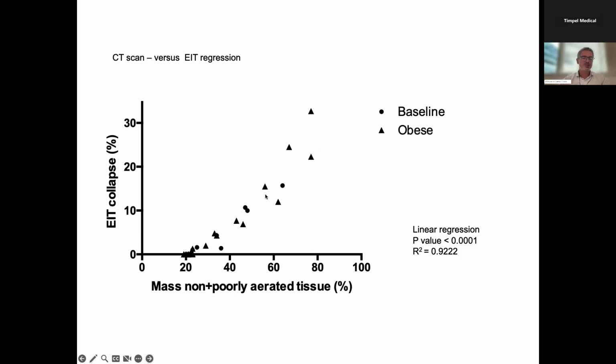So what this plot indicates is that there was roughly 20% of the lungs that, even at the optimal PEEP, was still 20% closed. 20% of the lungs was still closed even at the higher PEEP levels. So meaning that part of the collapse that you measure with CT could not be recruited by the pressures that you expose the lungs to. So this is a limitation in a sense of the EIT estimation method.